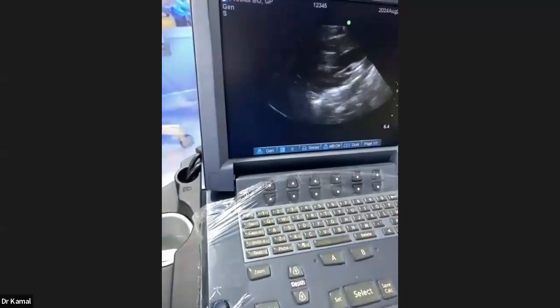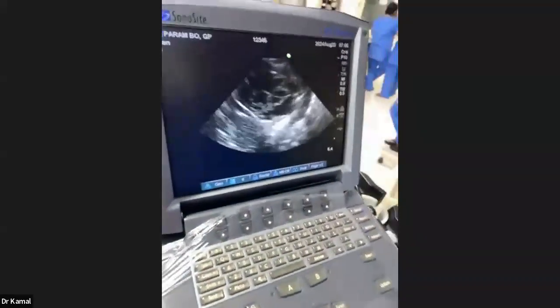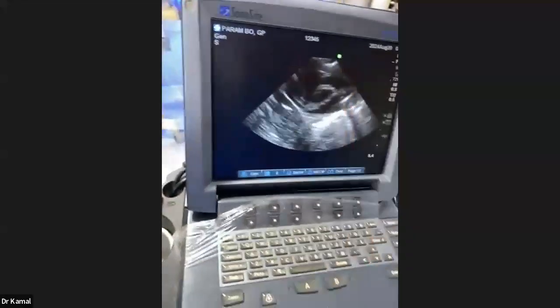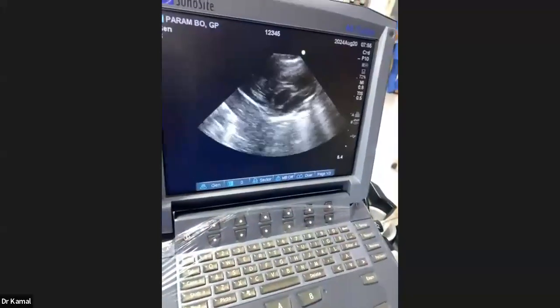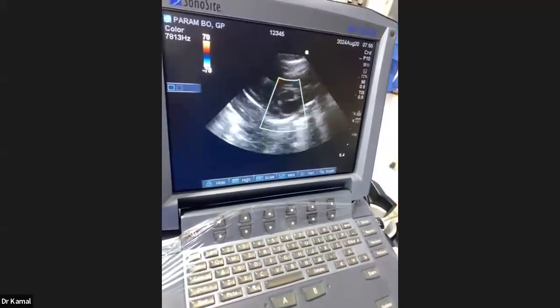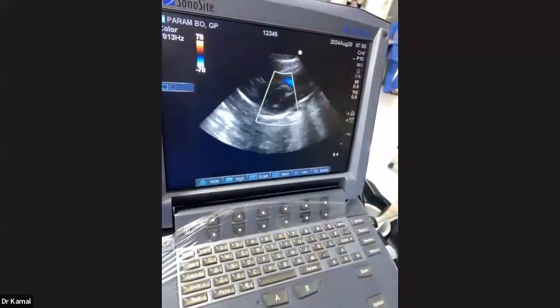So basically the point is, for practical purposes, the area of interest has to remain in the center. Black and white depends upon which point you are focusing on. Focus is on this place. So if I put a color over here, I'm interested in this point. I'm getting a very good image and this is the focus area.